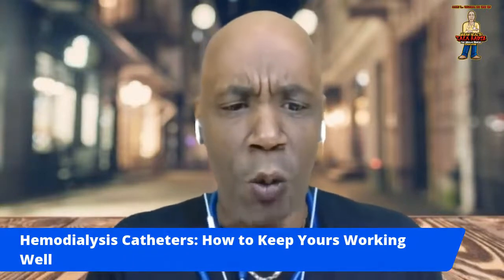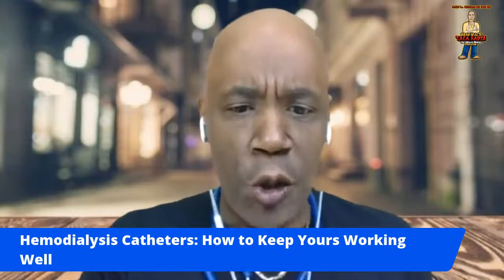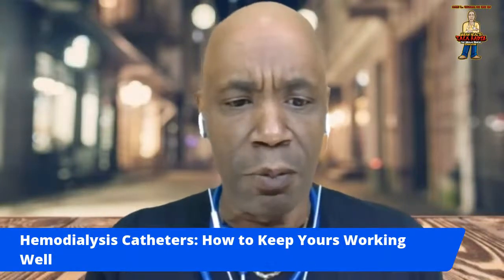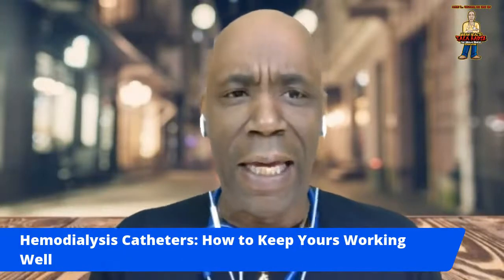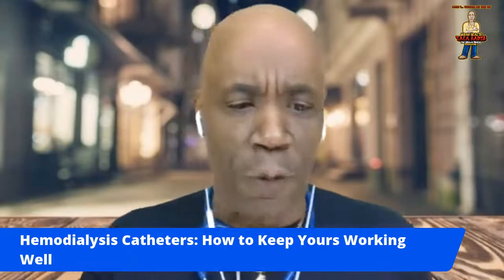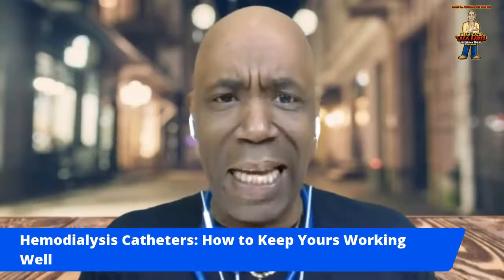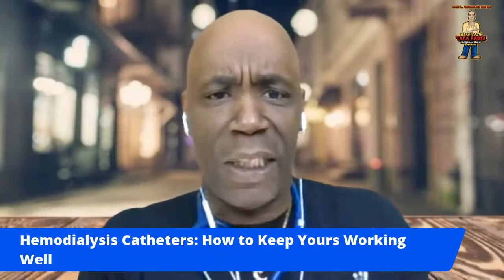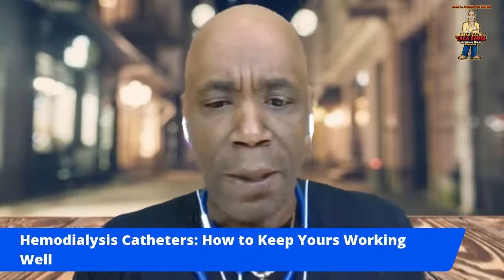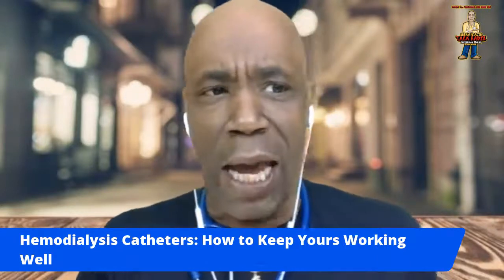We all know that hemodialysis is a treatment used when your kidneys fail and can no longer clean your blood and remove the extra fluid from your body. A hemodialysis access or vascular access, which is in your arm, is a way to reach your blood for hemodialysis.